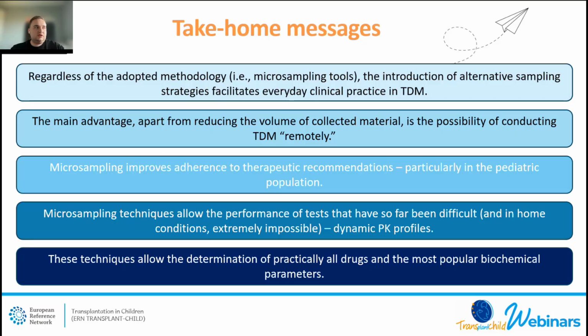As Jacek told, it's very practical for clinicians. The main advantage, apart from reducing the volume of collected material, is the possibility of remote controlling and performing the TDM process. Microsampling improves adherence to therapeutic recommendations.